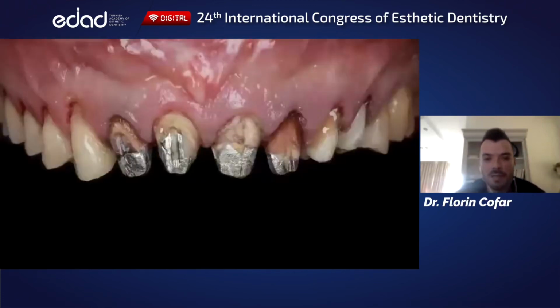So the last thing, we have to remove the old restorations. In here, you can see another bottleneck, which is color of both teeth and tissue. And it's always a problem when you're using monolithic restorations. Like if you would layer and have a good technician here, you wouldn't care. But if I would layer here, I would lose all the shapes from the library. I would lose the precision that I got from planning with Mojo.